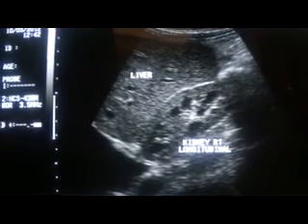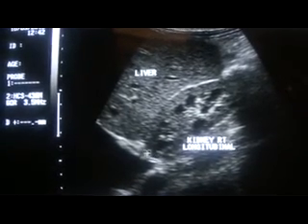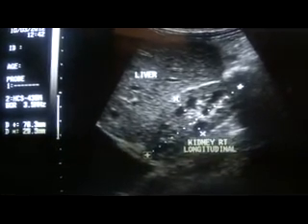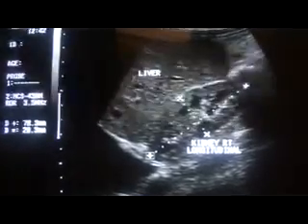Now to note in this kidney is the parenchymal ecogenicity. This is the capsule of the kidney and this is the cortex of the right kidney. Compare its ecogenicity with that of the liver. The ecogenicity of the kidney's cortex is slightly raised as compared to that of the liver parenchyma, which is opposite to the expected normal. Normally, liver ecogenicity is more or equal to that of the renal cortical ecogenicity or eco-brightness.